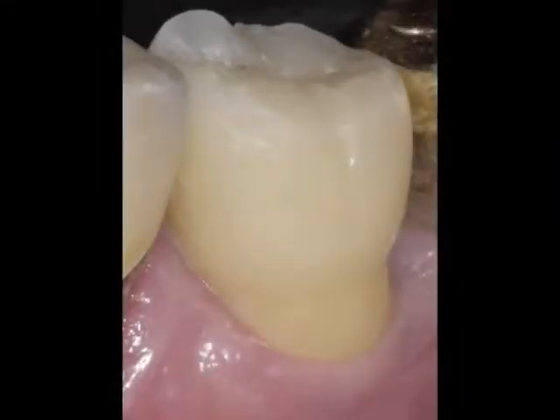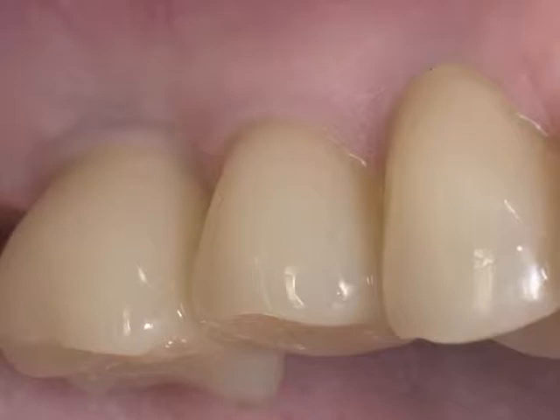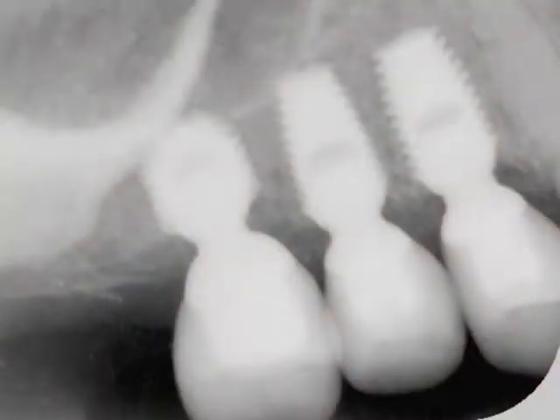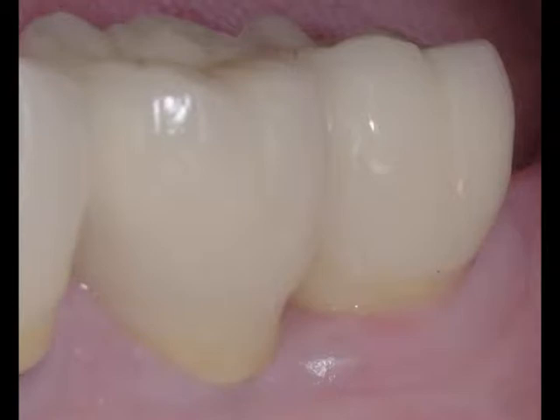Clinicians for whom the Bicon system is a new experience should be impressed with the flexibility, forgivingness, and facility with which Bicon implants can be placed and restored, even in challenging clinical cases.